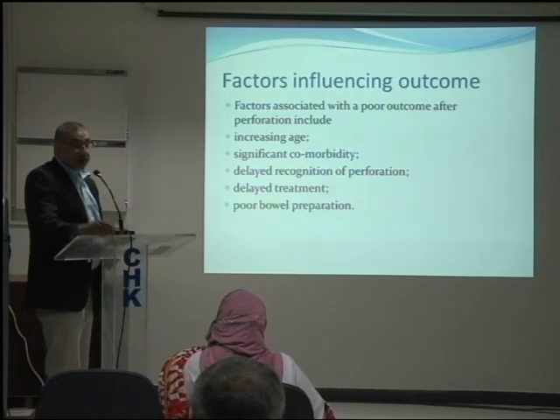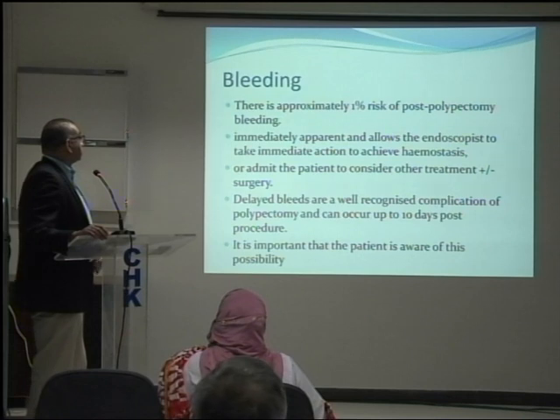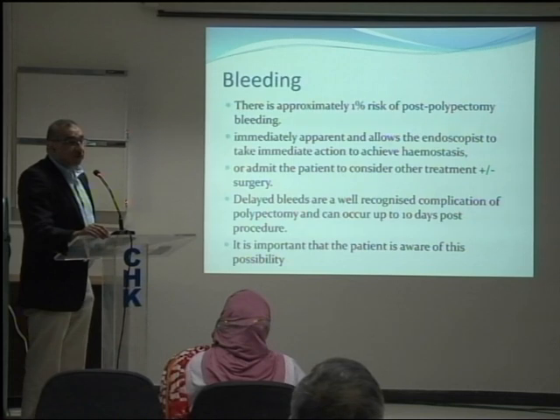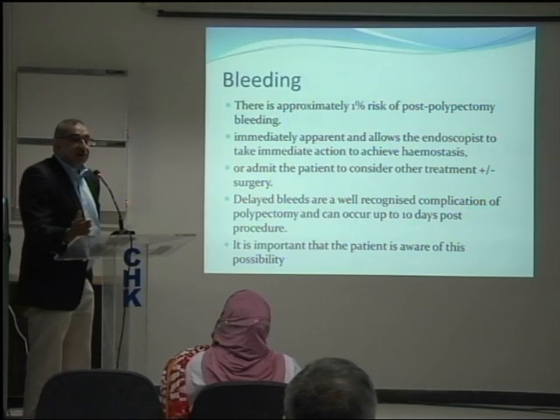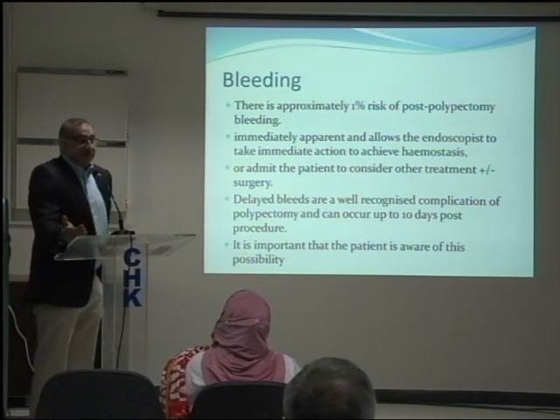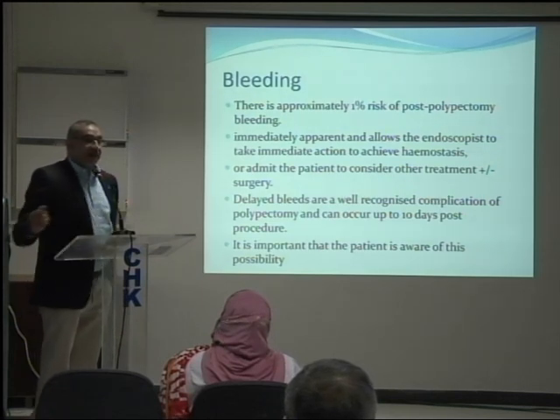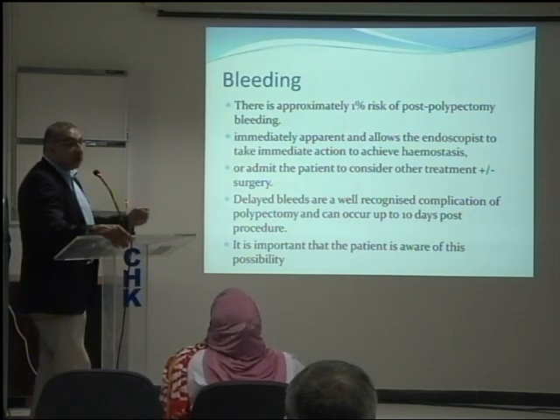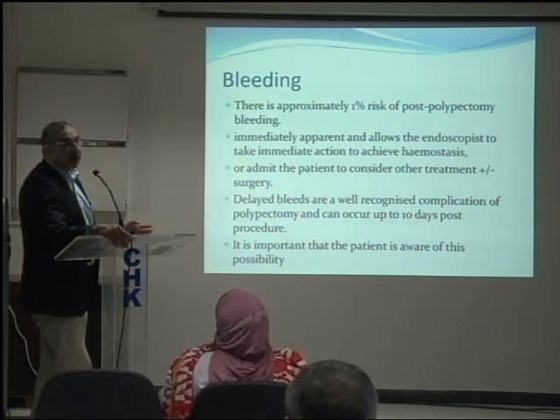Poor bowel prep, as Dr. Saab mentioned, if the bowel prep is good, the outcome is going to be good. Another well-recognized complication of colonoscopy is bleeding. Again, why would you get bleeding in a diagnostic colonoscopy? Highly unlikely, because unless you are really ramming the scope against the mucosa, then you can, but normally you wouldn't. Bleeding from pinch biopsy is very, very rare, highly unlikely.